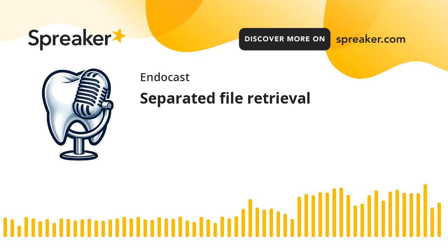Coronal or middle is easier than being in the apical. The size of the file: if it's a big or long file, the chance to do bypass will take time and effort. So maybe retrieval with the tools, as we will discuss further, may be a better option.